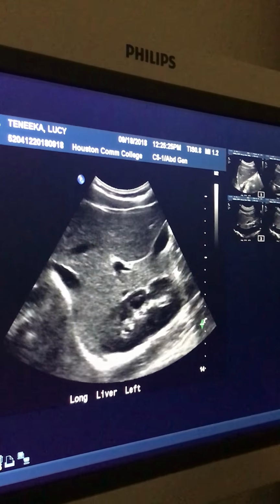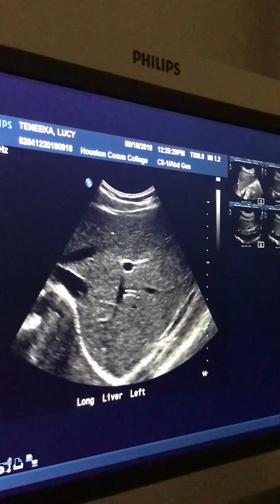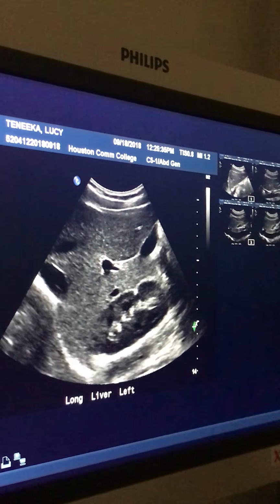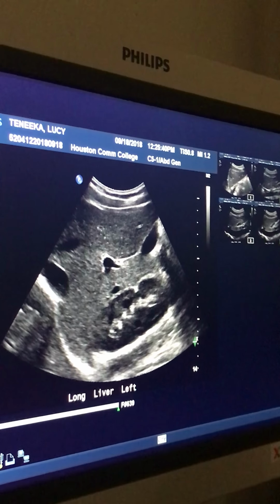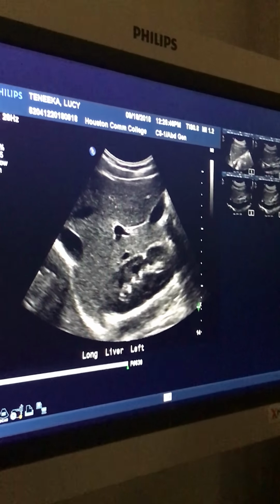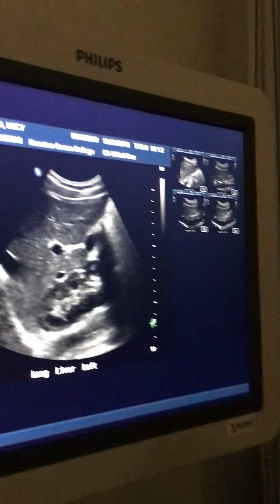Take a deep breath and hold it. The picture you want is like this. Let's see, I'm going to kind of twist. So there I twisted everything away, and I like this picture better. When I had that picture, that was okay too, but I don't love it. It's fine. I just feel like the IVC is about to open and go through. The liver looks a little twisted. It's kind of busy.